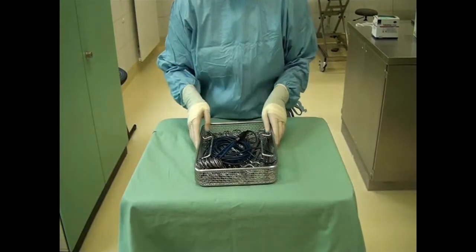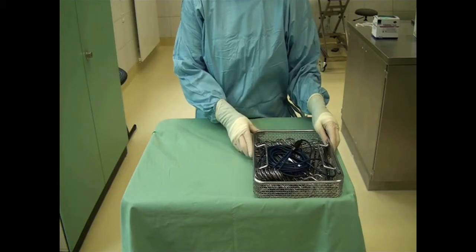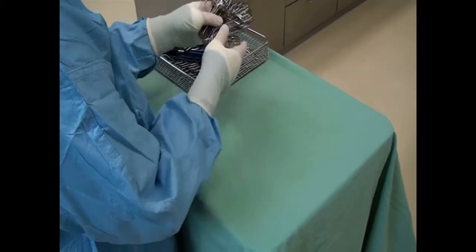The surgical instruments are contained in a tray. First, lay out the towel clamps and cauteriser.